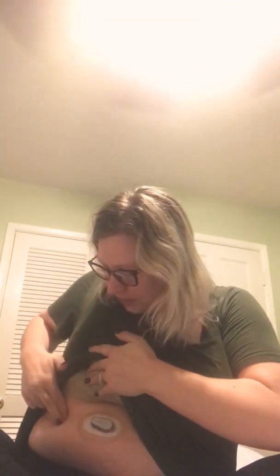While it's filling, I will actually take off the sticky part, because I have forgotten several times to take off the sticky part and literally try to inject it and it doesn't stick. And that sucks. But, alright, I've got my sensor here. I'm gonna put it over here. So I'm gonna go ahead, while that's filling, it's at 8 units now. And let that air dry.